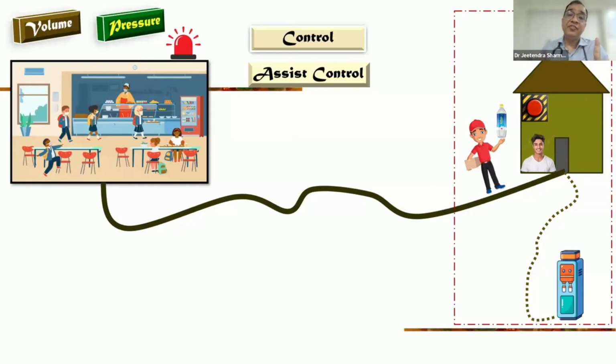If you press during this activated period, you will get this bottle a little bit preponed from the expected delivery, up to 1 hour, but not necessarily at 1 hour. Maybe 20 minutes earlier, maybe 30 minutes earlier, and even at the same time. Even if you don't trigger it, this bottle will come. If you don't do anything, this bottle will come at the same time, but no additional bottle will come.